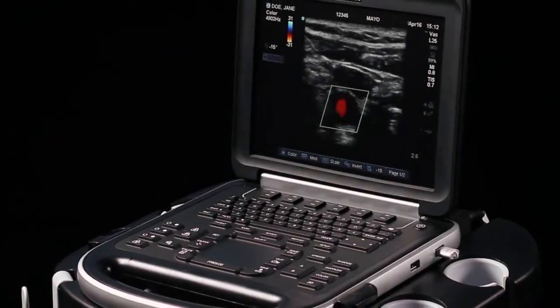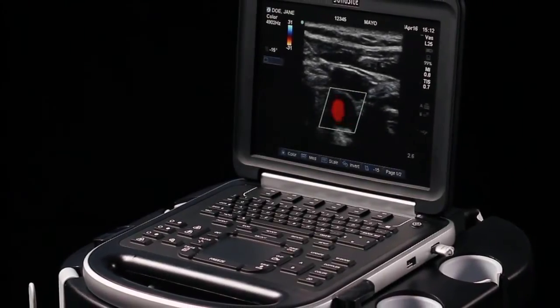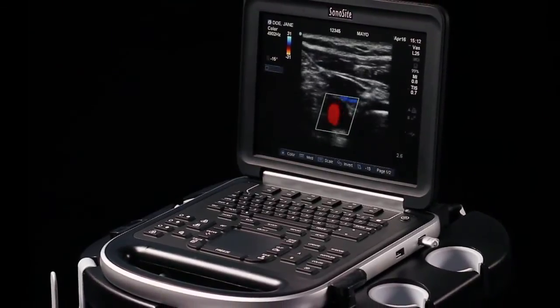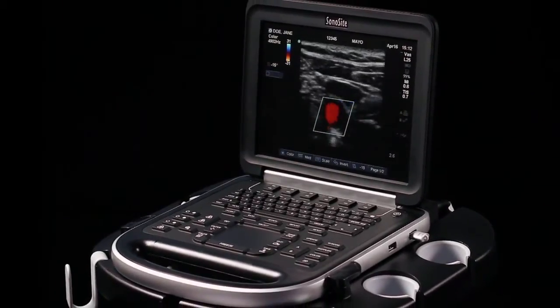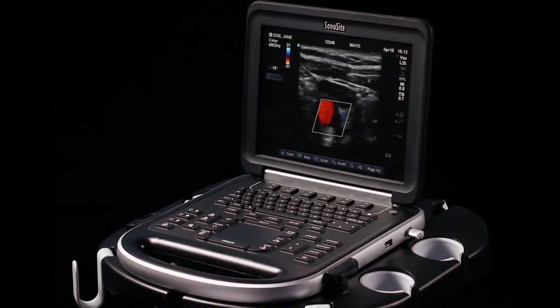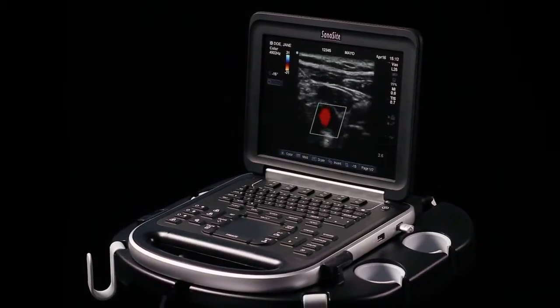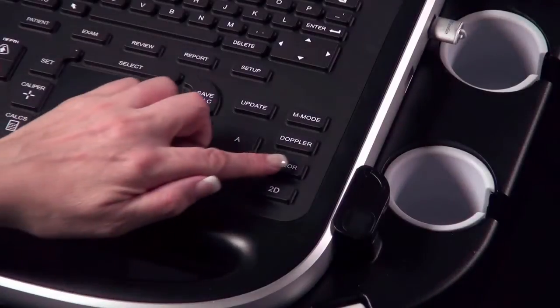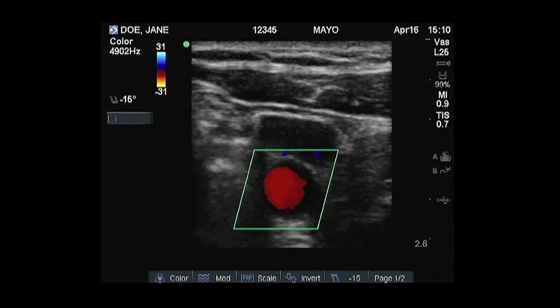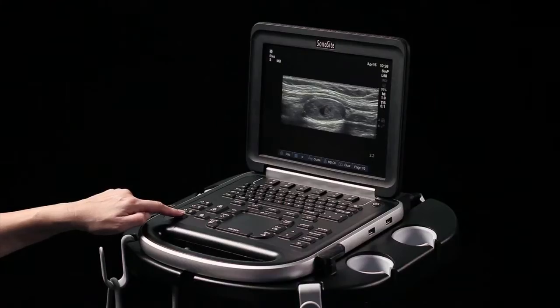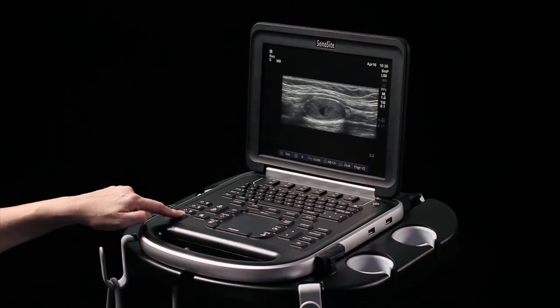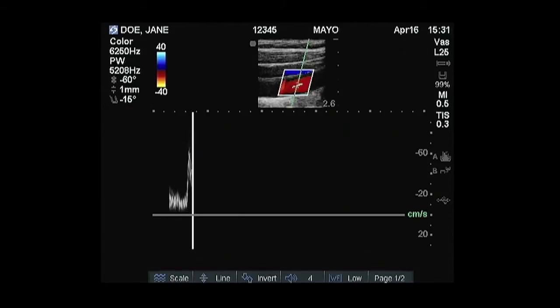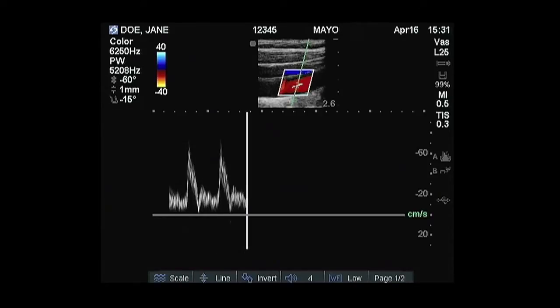The Sonosight Edge offers superb image quality and increased speed, along with Sonosight's traditional reliability in a laptop-sized unit. This short video will demonstrate the key features and functions of the Sonosight Edge system. For more in-depth information, please refer to the System User Guide.